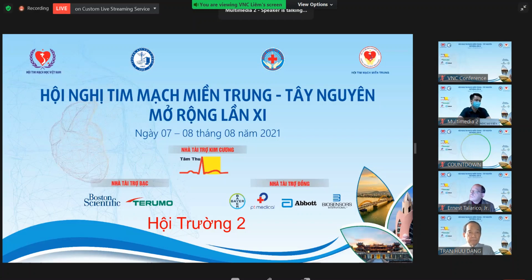Also, 2D echocardiography can provide faster imaging, especially in patients with acute coronary syndrome. We do it fast, then we move the patient to the DSA unit. 3D can be useful in cases of valvular diseases, and maybe we can try to use MRI for coronary syndrome also.